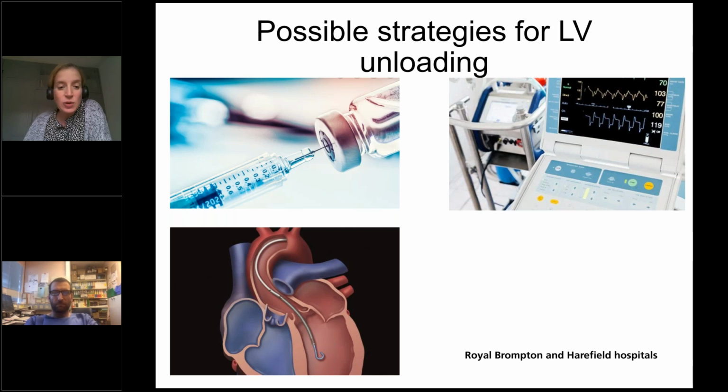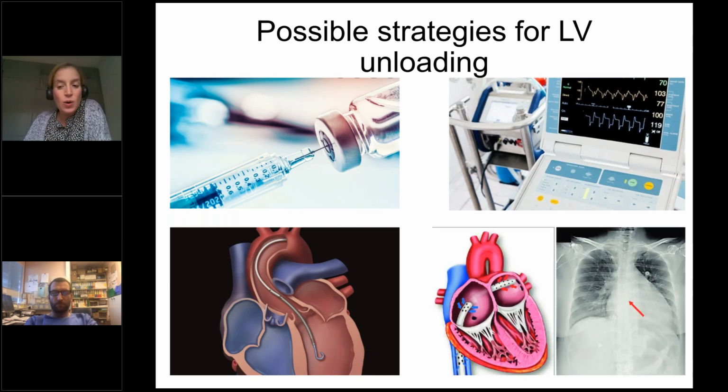Some other people do an intra-atrial septostomy in some centers, and there are a few published cases in the literature about something called LAVA ECMO, which is a complex peripheral VA ECMO approach that some centers use when they predict that they will run into trouble with LV distension on peripheral VA ECMO. They insert a special venous drainage cannula across the interatrial septum that is multi-perforated, as you can see here, and you can achieve biatrial drainage, hence inherently achieving LV offloading at the same time that you provide systemic perfusion with ECMO.